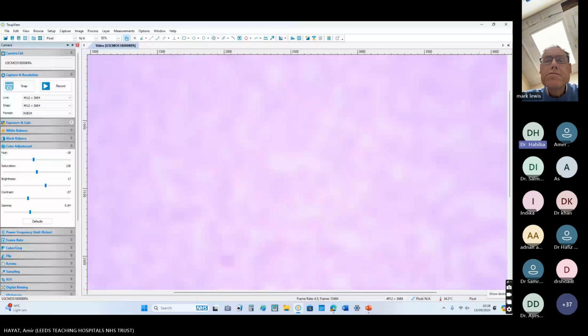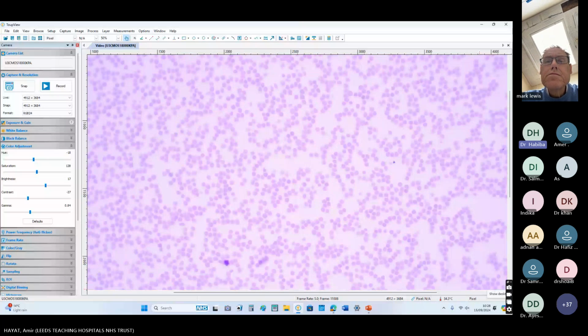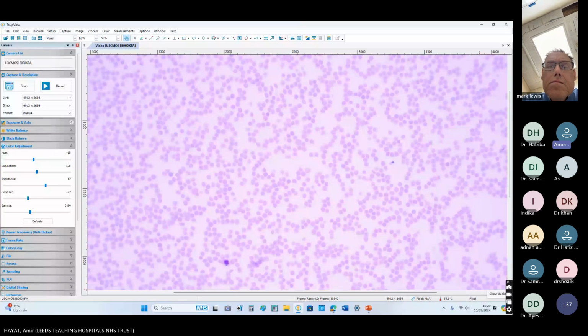Pardon me, what were the cytopenias again? So the pancytopenia? The patient has progressive cytopenias, anemia and thrombocytopenia, and progressive fatigue as well. And on clinical examination, the patient has abdominal discomfort due to a large spleen.